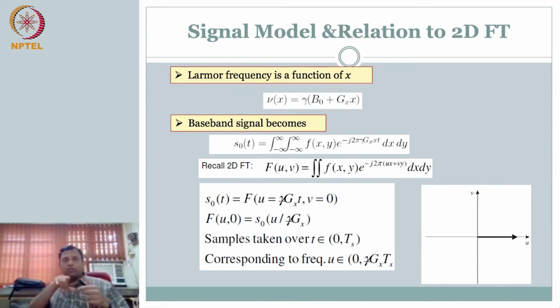We said, why don't we acquire several projections and therefore populate the Fourier space. Once you have the Fourier transform of the object, I can get the object as the inverse Fourier transform. So we acquired different views, different projections, took the Fourier transform, constructed the Fourier transform of the object, and then obtained the object as the inverse.